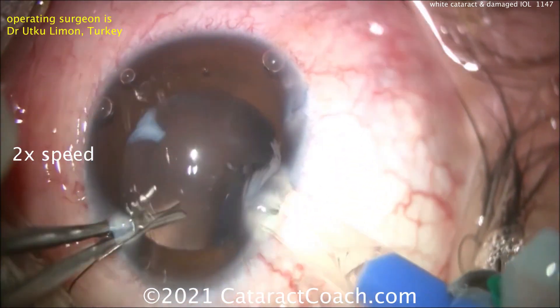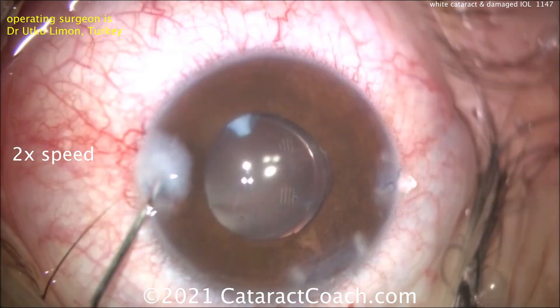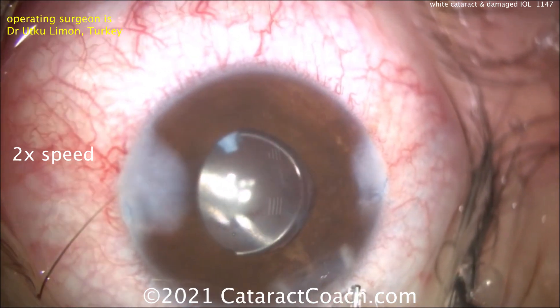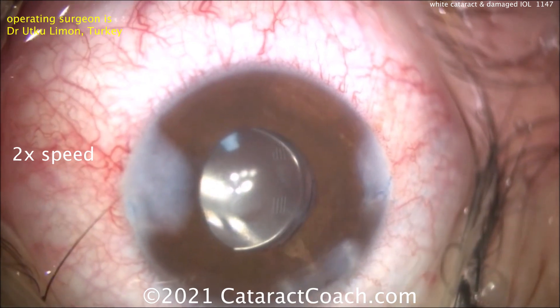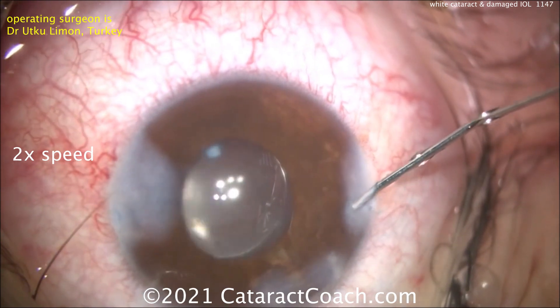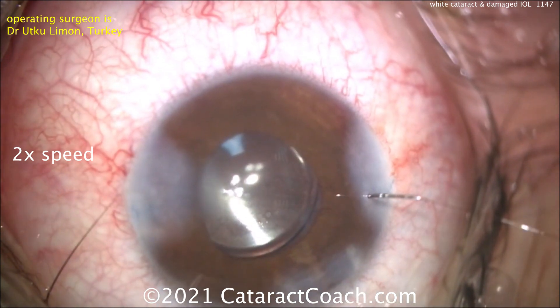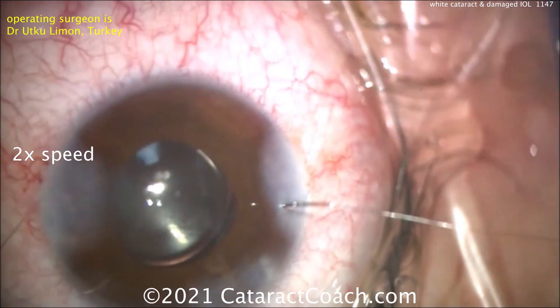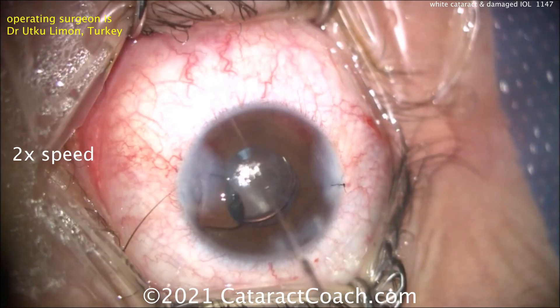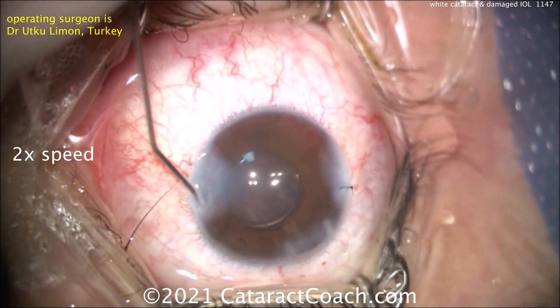Now you've got to be an expert surgeon to get the new lens into the capsule bag. The reason is that the posterior capsule has already been opened with the posterior capsulorhexis, and you don't want any issues of vitreous prolapse while doing the lens exchange — luckily all went well. Remember, this single-piece acrylic lens is in the capsule bag, but with both an anterior and a posterior capsulorhexis, the remaining capsule is like an empty car tire, and you've got to get this IOL securely placed in that rim of tissue.